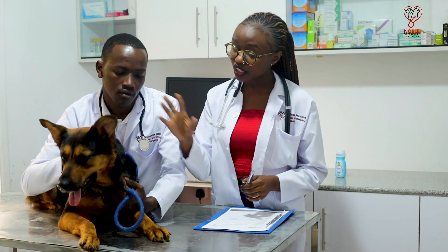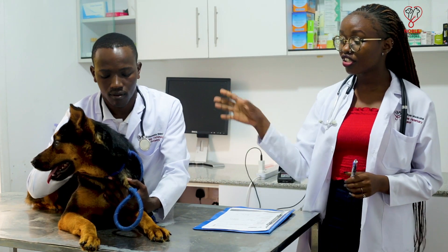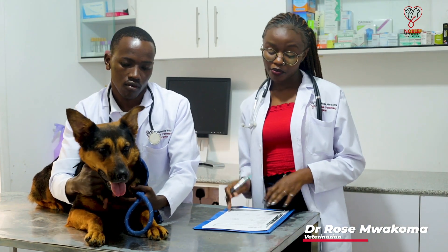The next thing we do is check the general demeanor of the animal — whether the animal is bright, alert and responsive, and is aware of its environment.